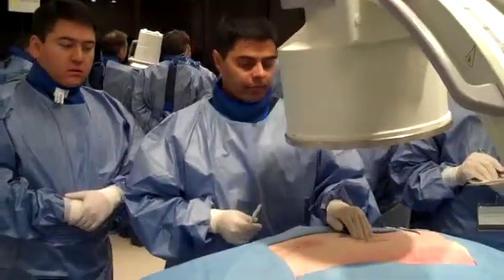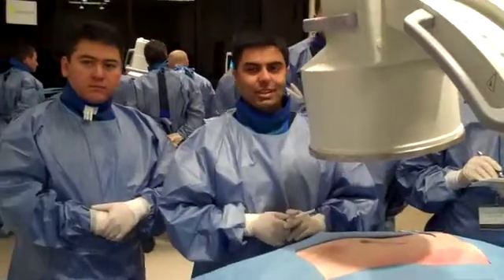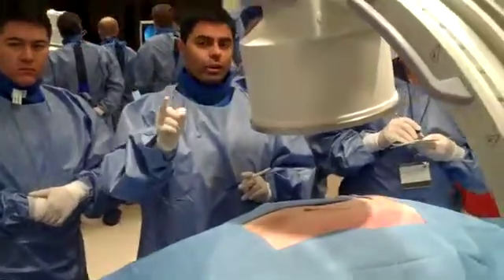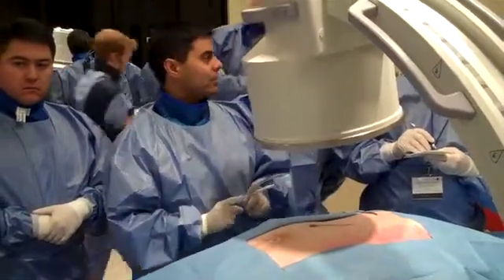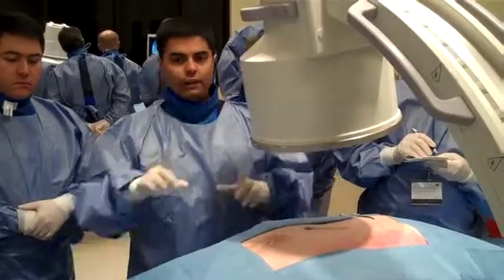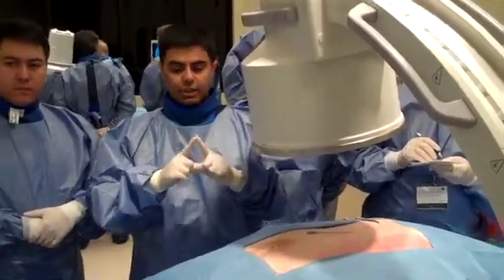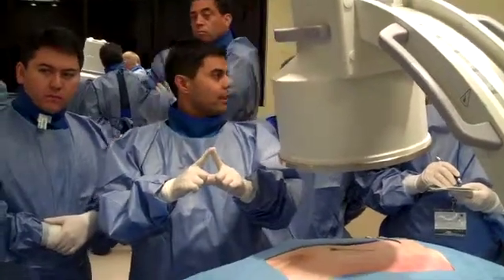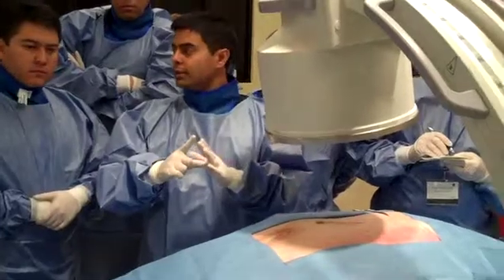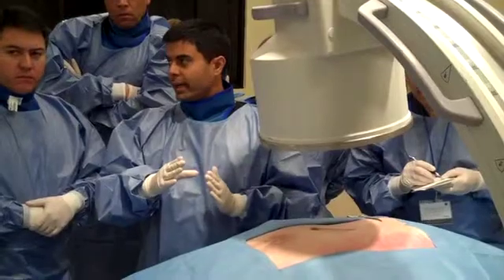This person is a little bit bigger, but the spine — I can feel the spinous process — it's probably not going to be an issue. The idea is that we're looking for an ideal angle, and our ideal angle is actually dictated to us off of the spinous process. If you take a look at the spinous process, it's shaped like a triangle. So if we're looking at our spinous process in a shape like a triangle, we want our needle entry to go and be parallel to the triangle.